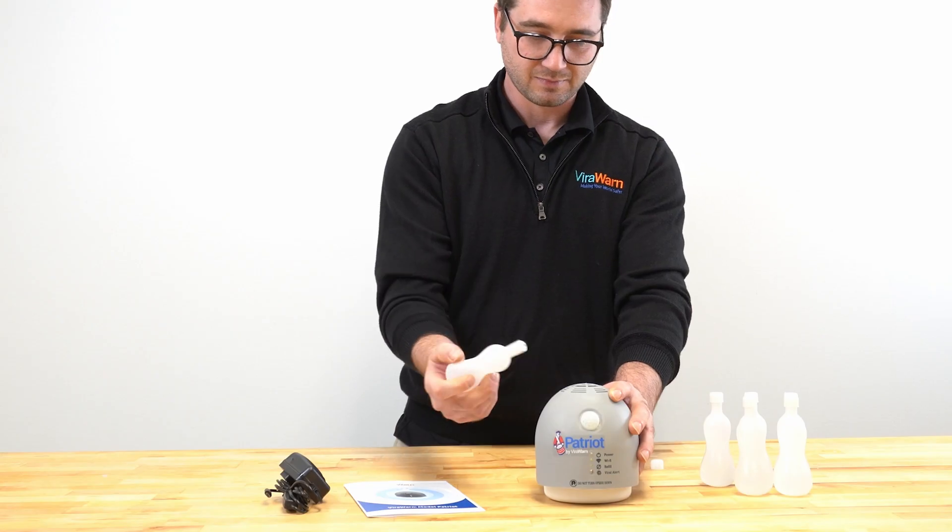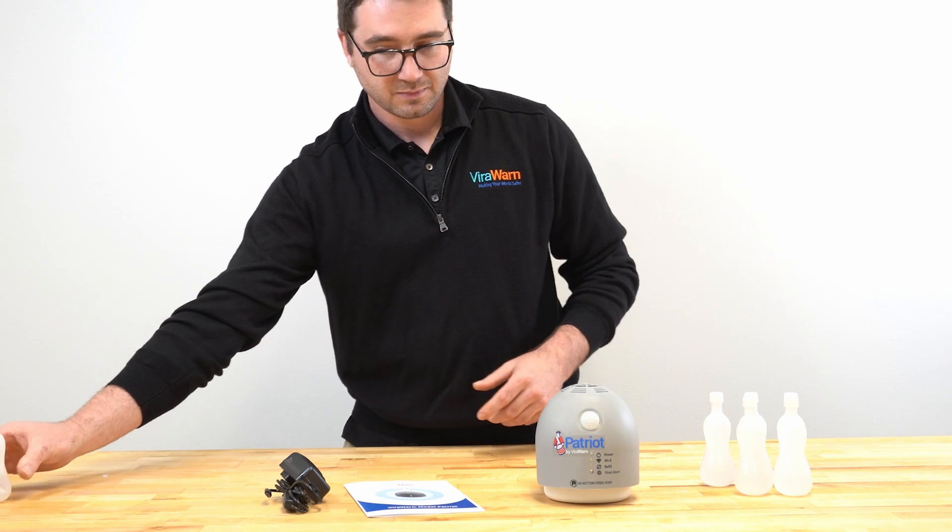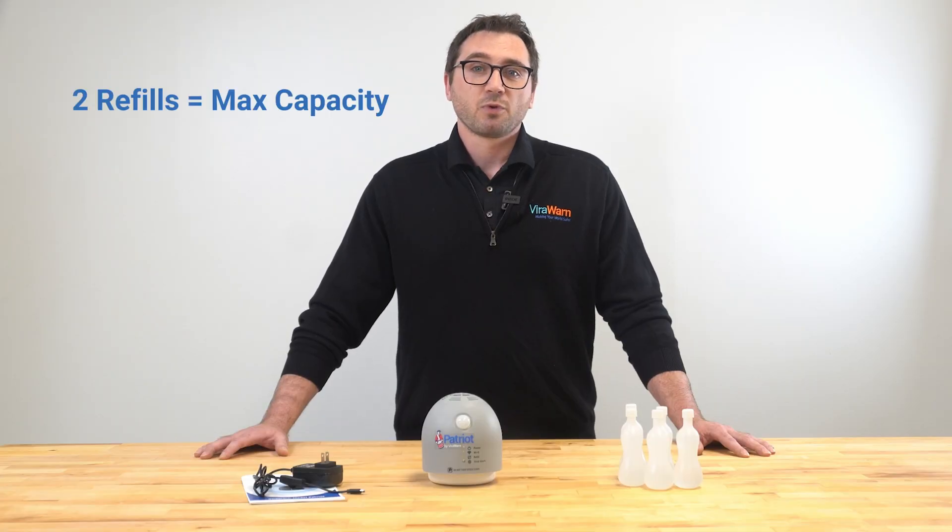When the liquid media has fully emptied from the first bottle into the device, repeat the same process with the second refill bottle. Now that the device has been filled to capacity by the two refill bottles, you can discard the empty bottles. Maximum capacity for the device is two refill bottles. Please do not overfill the detection chamber.